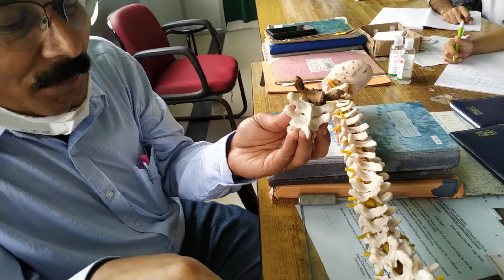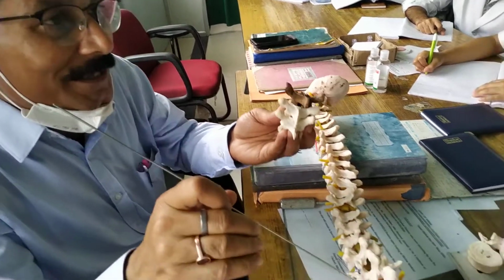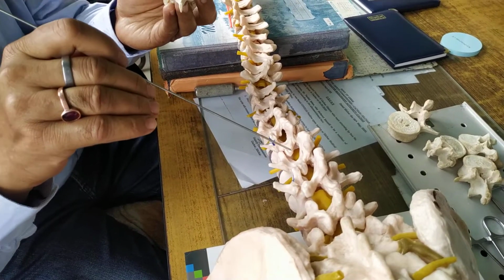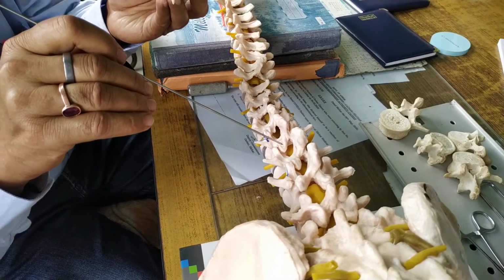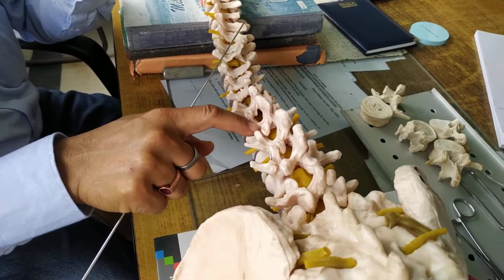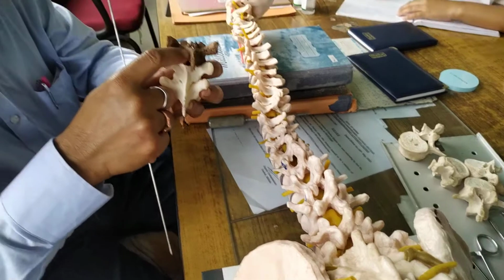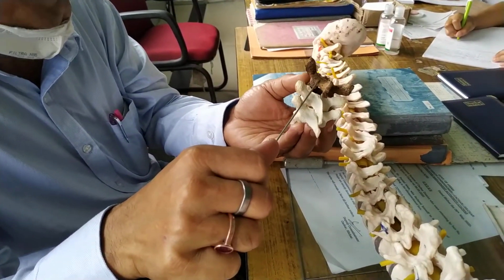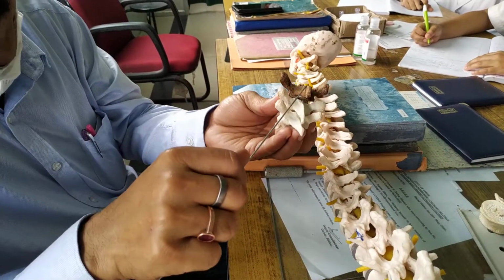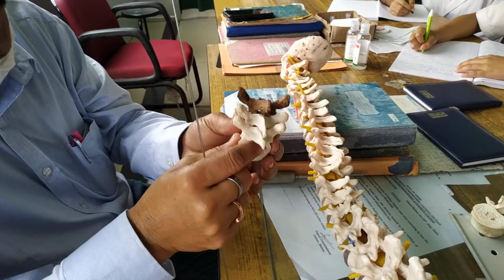In the lumbar area, you will find the facet joint is very prominent, and one can find it easily. If you dissect it, you can easily find out the superior articular surface as well as the inferior articular surface of the vertebra. And if you put your finger over there, one can also palpate it easily while doing dissection. This is not the situation in the thoracic area, where you cannot find the joint very easily, because the orientations of the thoracic facet joints, as I said, are overlapping each other.